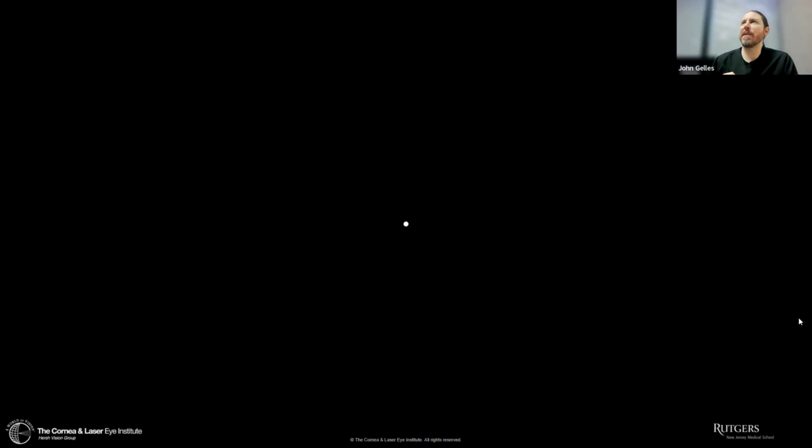A fun thing to start off with when you're giving a lecture on higher order aberrations is to demonstrate higher order aberrations to the individuals who are attending the lecture. What you're seeing here is a perfectly black background with a perfect white spot in the center. Take a look at that white spot. What you'll notice is that it's not a perfectly round white spot. There's a little bit of fuzz or blur around the edges of that, and that is higher order aberration.